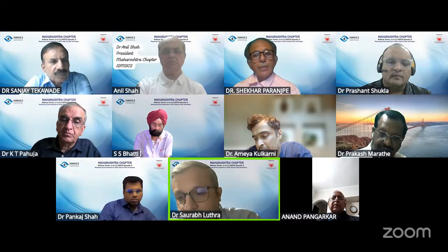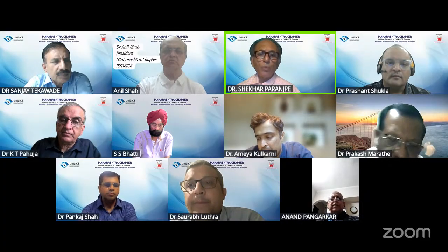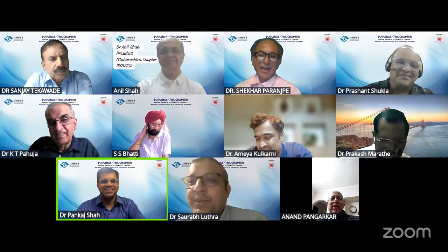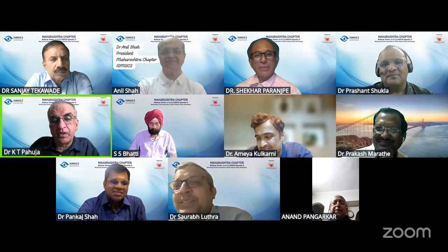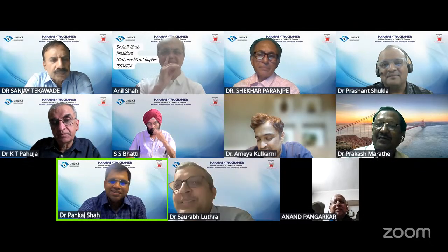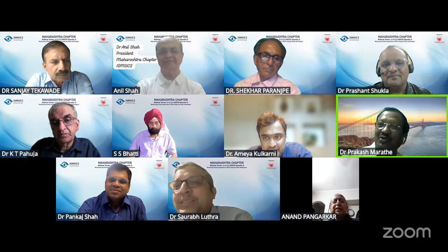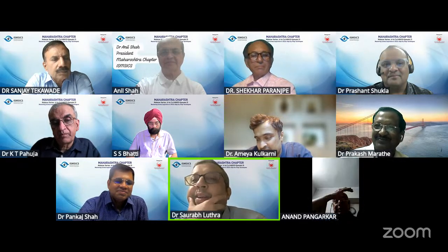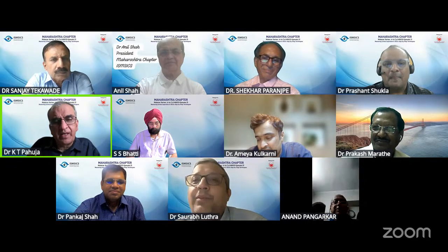This is approved, sir? I mean, to be used intraocularly, is it approved by the FDA or something? No, sir, it's not something that is approved, but it's personal experience that it just works. We'll ask SICS to approve it. What suggestion Dr. Saurabh is giving, probably you can have a patent under your name. Yeah, maybe. It can be published and popularized. I mean, if only 10 people in the world are using this, I think a population like us, not many people are using, sir.